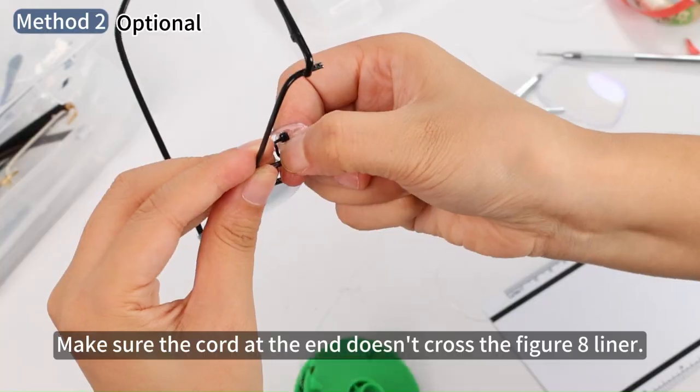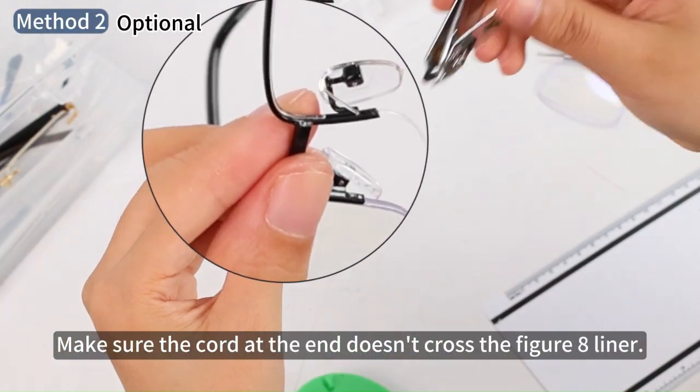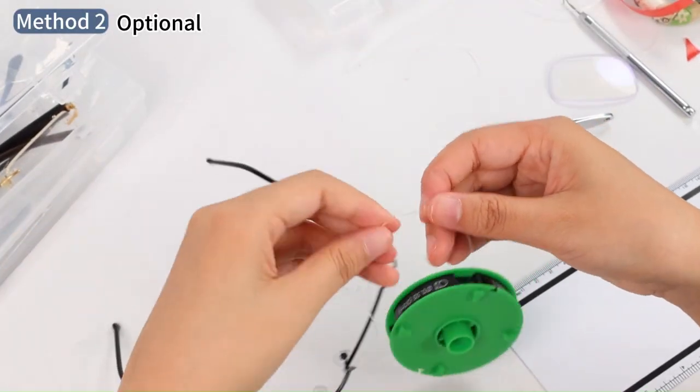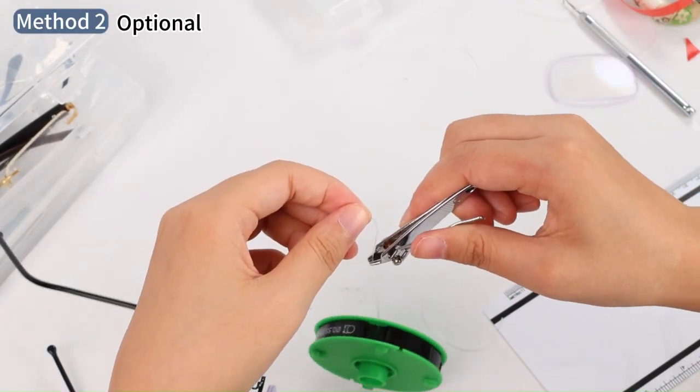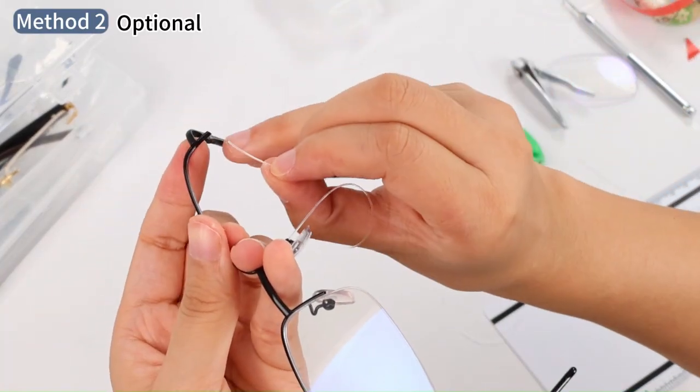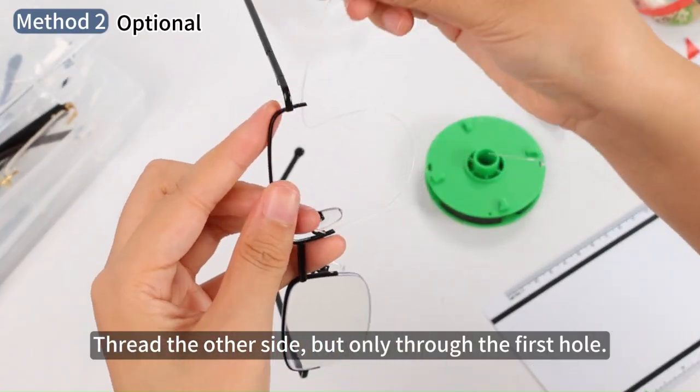Make sure the cord at the end doesn't cross the figure 8 liner. Take note of its length. Thread the other side, but only through the first hole.